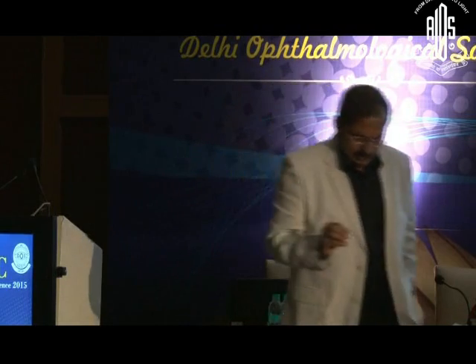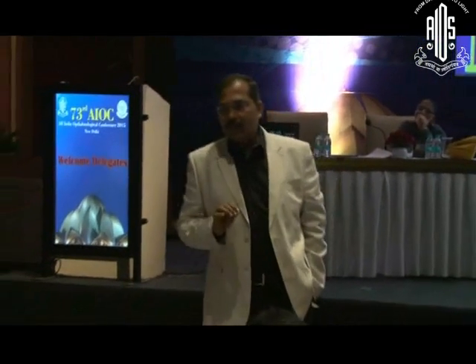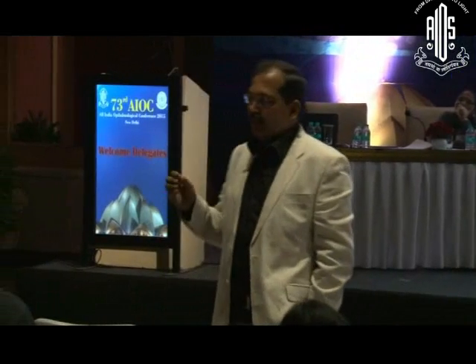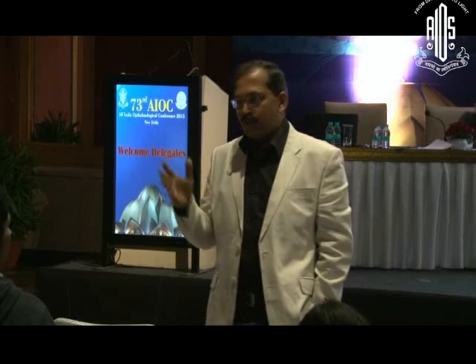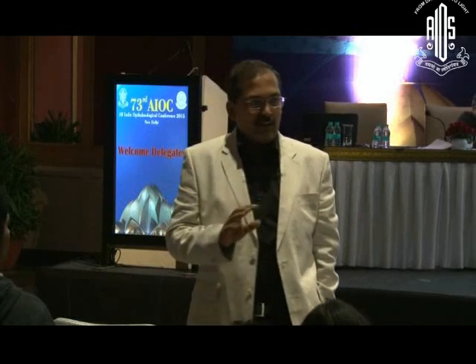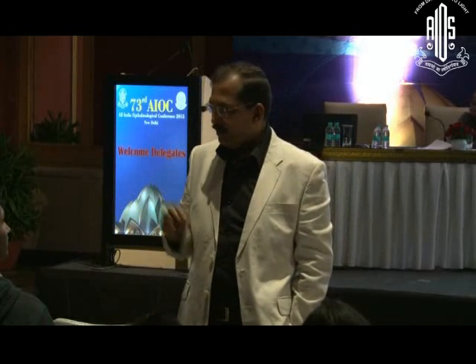Now the patient was planned for a plus 20 diopter implantation in the bag. Something happened, there was a PC rent, so we had to put the lens in the sulcus. You have an inventory of lenses. The patient required plus 20. So now how much power modification do you make to put it in the sulcus?